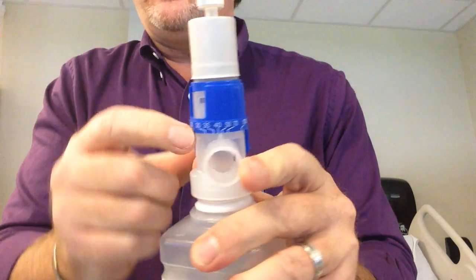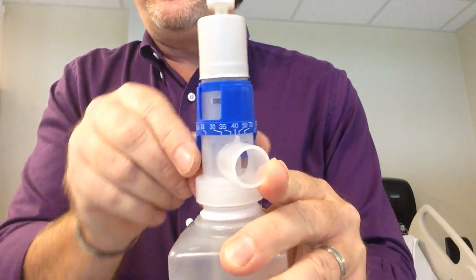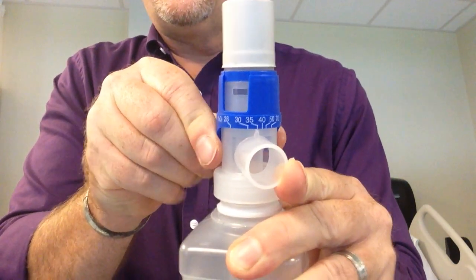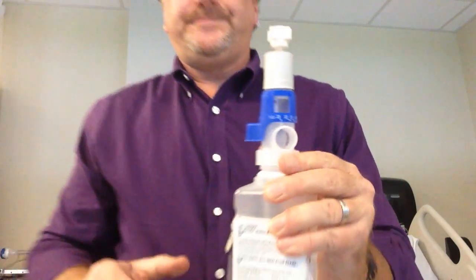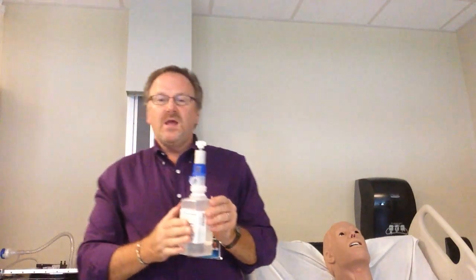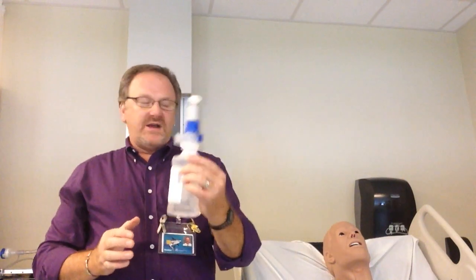This is where the magic box comes in. Notice there are no liters per minute markings — instead you see 35, 30, 28. I'm going to set it on 28, so now this is ready to go.